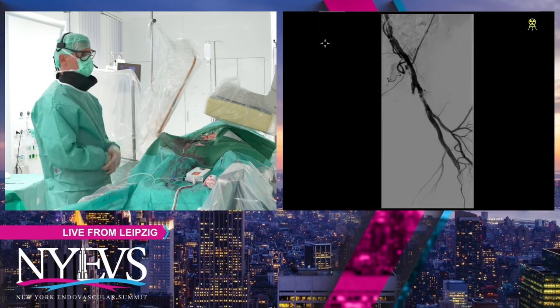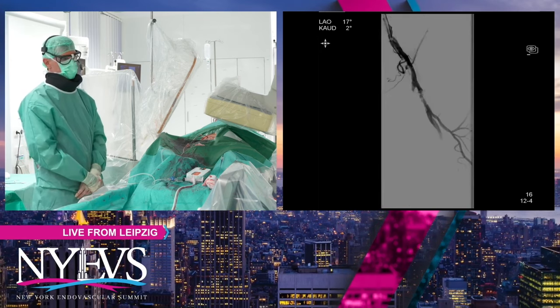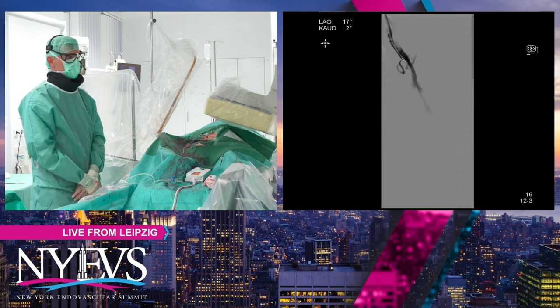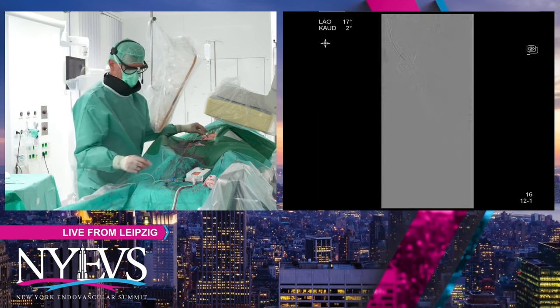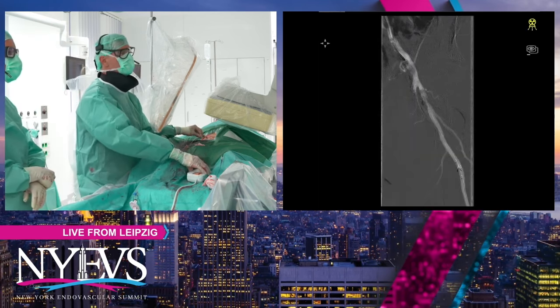Yeah, so that's what we usually see, or more. That's why I prefer to have an 8 French crossover, because sometimes these filters are so blocked that they do not fit through 7 French anymore. Okay, so maybe I continue now a little bit here. It looks like there's some debris in that filter, as expected, I think, with this.